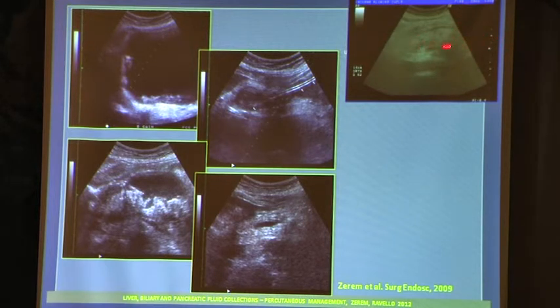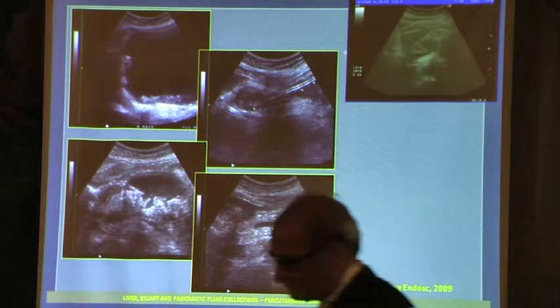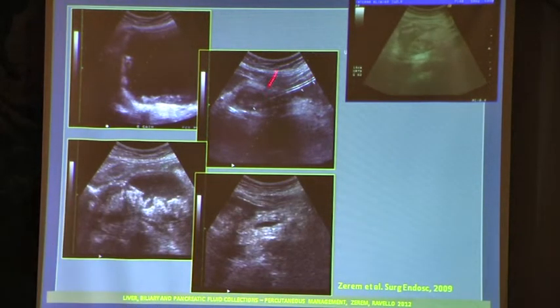This is massive pancreatic and peripancreatic necrosis, in order to eliminate secondary fluid collection arising after destruction of the necrosis. This is a large acute fluid collection in acute pancreatitis with necrotic tissue at the back, but normal pancreatic tissue is not visible. This is a catheter in the back for evacuation of acute fluid collection surrounding massive pancreatic and peripancreatic necrosis.